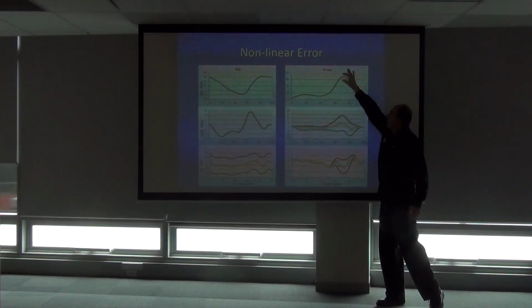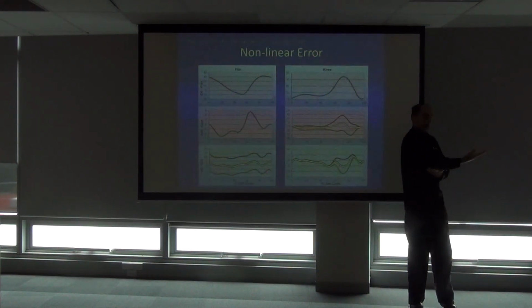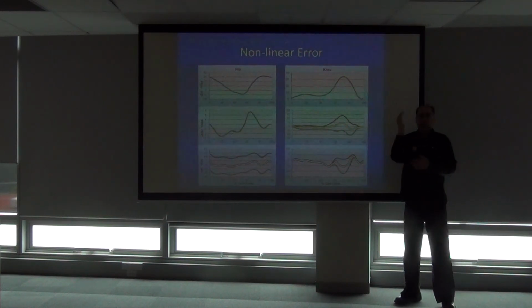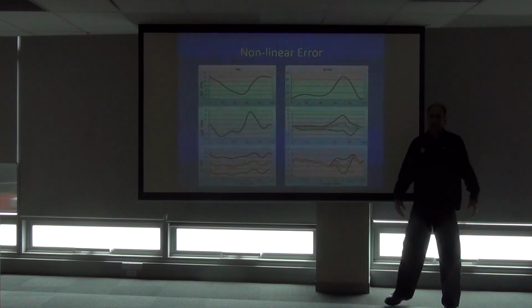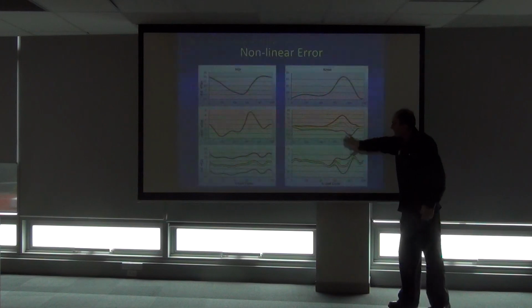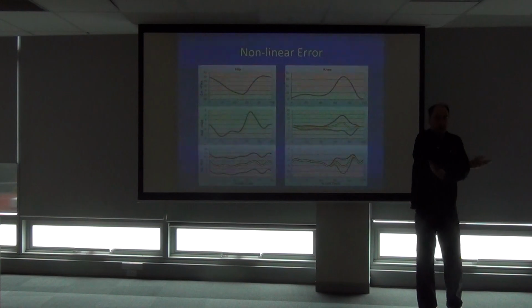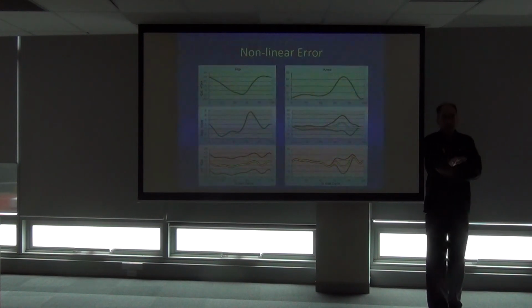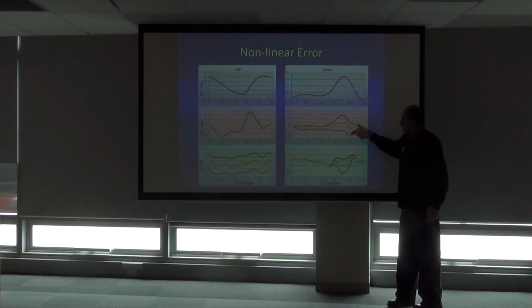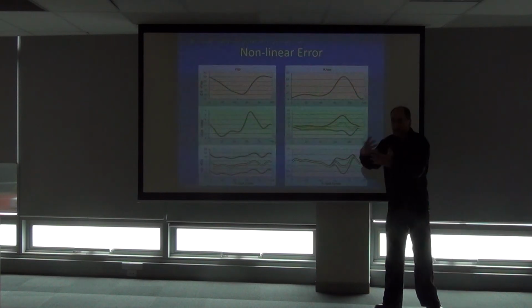Knee, it has affected the knee. If you zoomed in on there, you can see some variations in the knee. Instead of going there, we've gone out this way and then come around, or that way and then come back and then another twist. It has affected the knee, but only very small, quite hard to see. But it has affected the calculated knee abduction, adduction, internal, external rotations. That's the correction to come back in and the correction with the actual rotation. And it's produced some characteristic offsets by that axis misalignment.